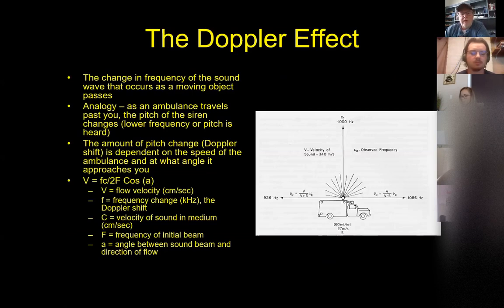Okay, the other thing that we'll talk about is the Doppler effect. And everybody probably heard the word Doppler before from physics. The best example of the Doppler effect is, let's imagine that you pull out a lawn chair and go sit next to the railroad tracks. You're 10 feet away from the track because it's a nice day, and you're 6 feet, you're social distancing from everybody, right? And you happen to like trains, okay? So it's going to make your day when the train comes by.